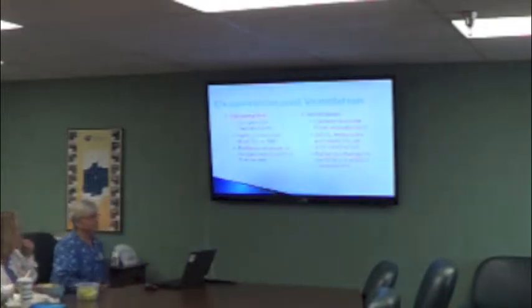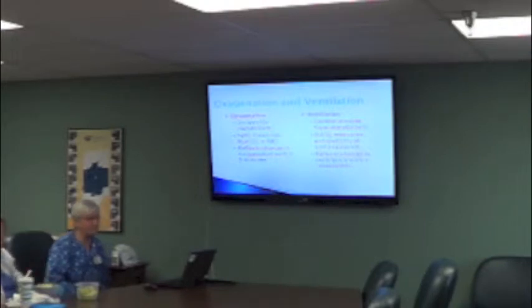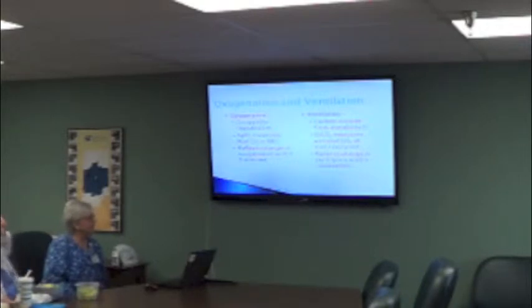The difference first between oxygenation and ventilation. We all know what oxygenation is and how to use an oximeter and what it does. But the oximeters take a few minutes, up to 5 minutes, to show changes. When we drop the oxygen or increase it, we always wait for a little bit and we go back and we see what that change is going to be. Where the difference in capnography is, it can reflect the change in ventilation just within a few seconds.